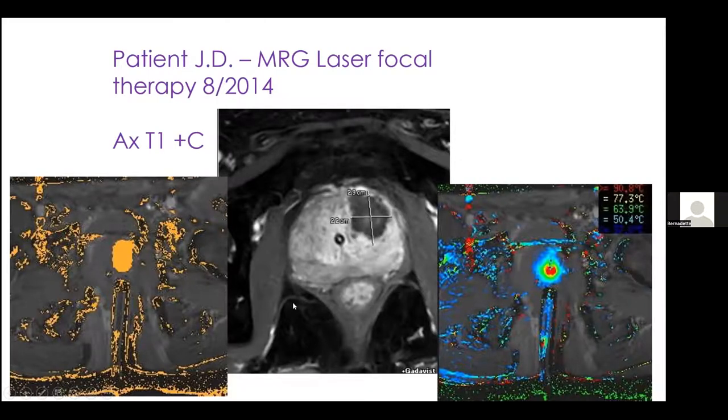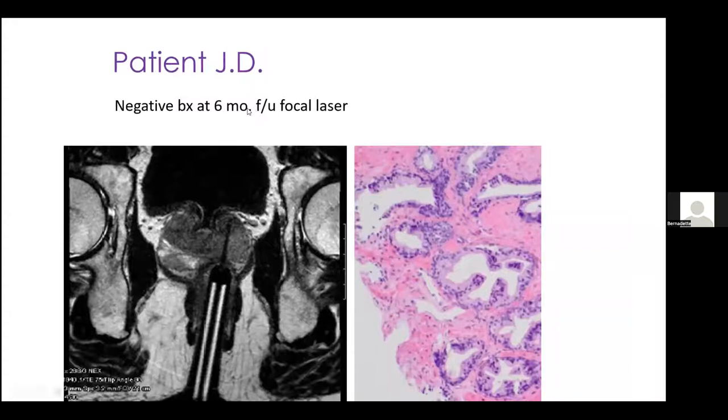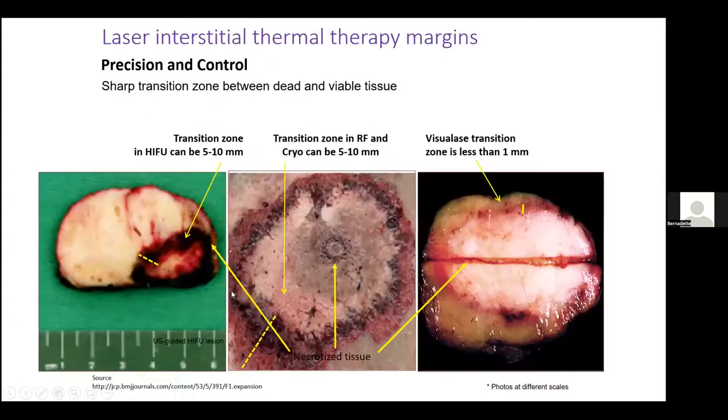There's the thermal map showing what we were killing as we killed it. And then this is a side view of that same tumor. Up here is the bladder. See that white area? This blob here is the prostate. This blackish grayish area is the coagulation necrosis that we induced. And this man came back for his 6-month follow-up. Because he was a research subject, we always biopsy the treatment area, even in the absence of imaging findings, to make sure there's nothing microscopic brewing that may declare itself later. We always biopsy the treatment site. And he had a negative 6-month biopsy. And he's living happily ever after.